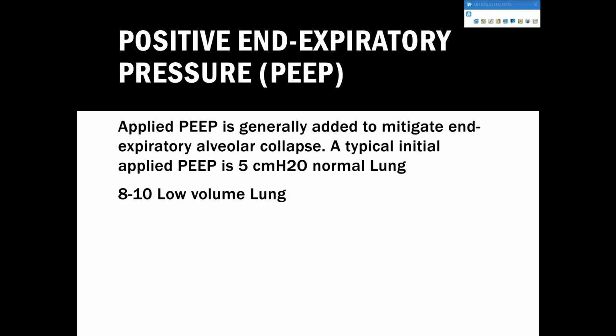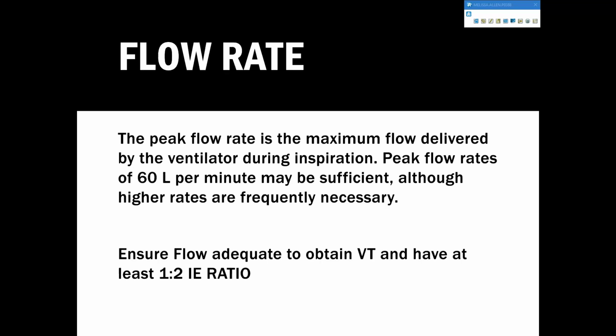And this is all going to be disease specific, but if you know that patient has pulmonary disease, I think what happened with our basic ventilatory stuff is we have gotten away from having a ton of pulmonary disease on a regular basis. What we end up having in the ICU more often than not is they have some other issue and they're intubated to protect airway, whether it's an overdose or renal failure. And so we tend to get away from some of our basic respiratory modalities. So this is just a little reminder.